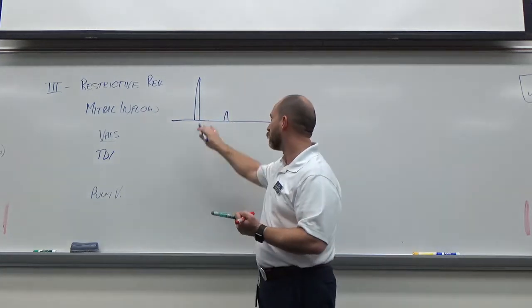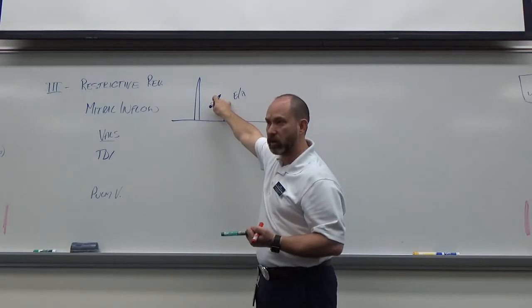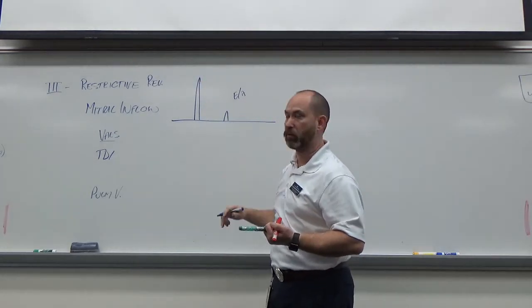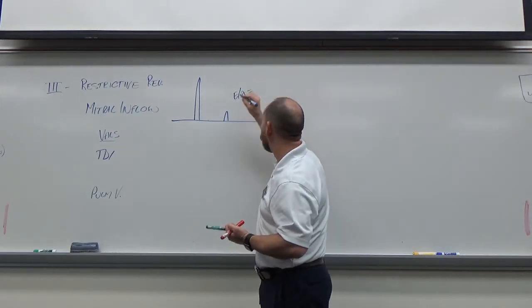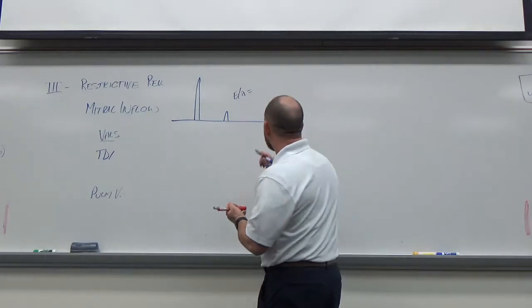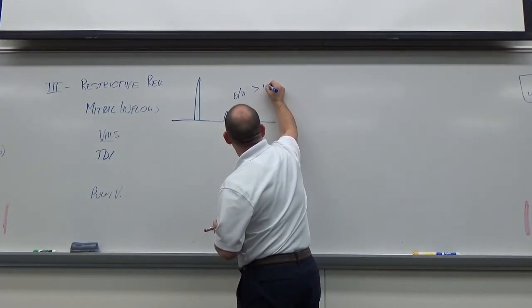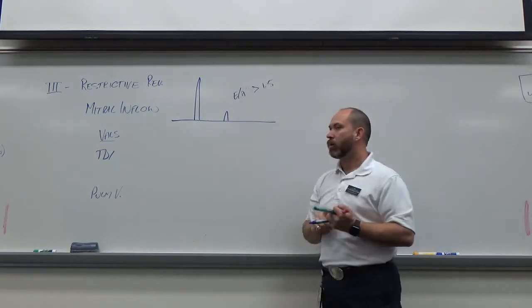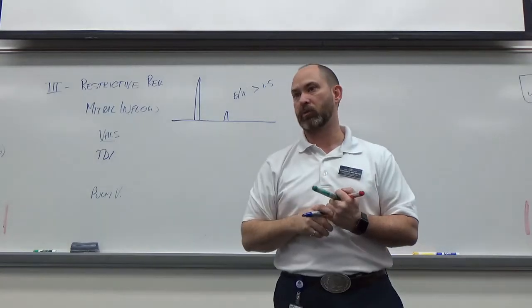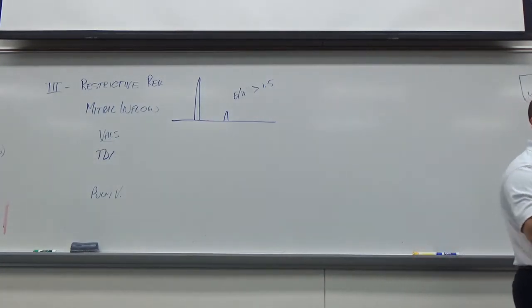So what is the EA ratio here? E is just taking the peak of the E and dividing by the peak of the A. That's what gets my EA ratio. So what is the EA ratio for restrictive? Greater than 1.5. That means the E wave is at least 1.5 times taller. Some charts may even show it as 2 instead of 1.5. So it's significantly taller.